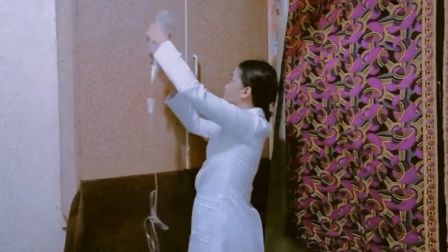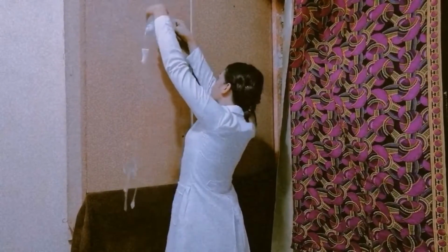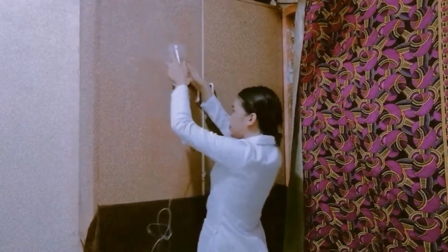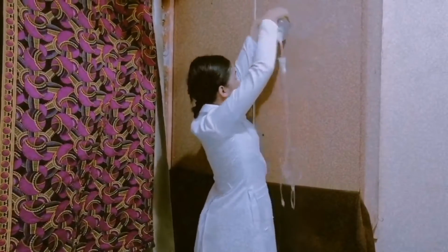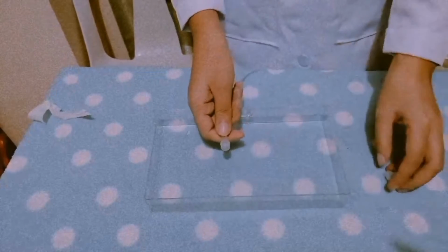Suspend the IV solution on a hook in the preparation area and press the drip chamber and allow it to fill at least halfway. Suction effect causes fluids to move into the drip chamber and also prevents air from moving down the tubing. Remove the cap at the end of tubing.